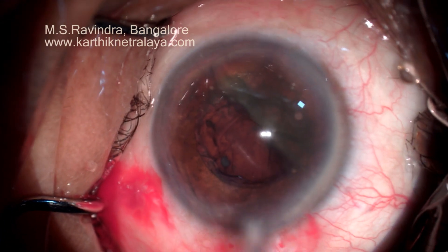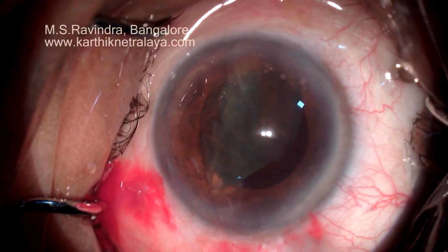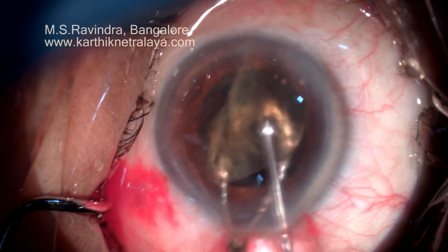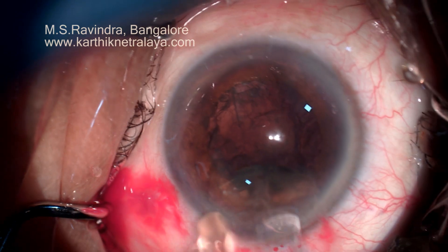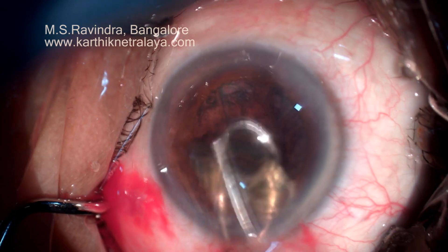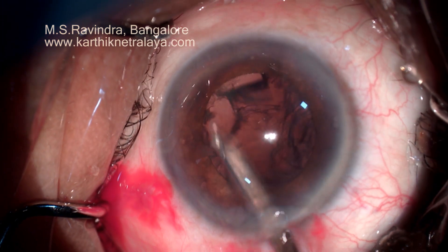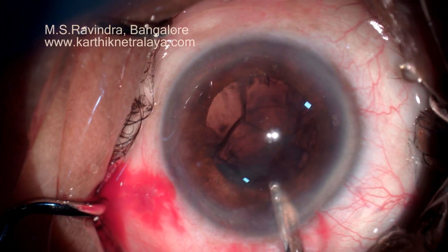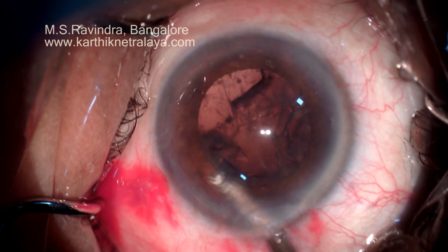It is supported behind by a mini-vectis. The pieces of nucleus are removed and see that the tunnel is not stretched during the procedure at all. This maintains the integrity of the collagen at the tunnel and it doesn't leak post-operatively because of this.